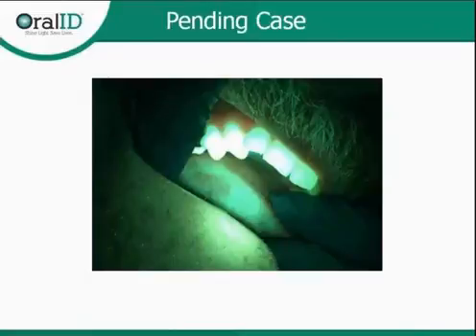So here's another case study. This is another instance where the doctor had been using our device for a couple of weeks, and he didn't see anything for all that time, and that's normal. So I don't want you guys to start to get paranoid that, I'm not seeing anything, so I must be missing something. That's not necessarily true. Also keep the peace of mind of knowing that just by looking at all, you're doing so much more than so many other dental offices out there for your patient. So just keep that in the back of your mind.